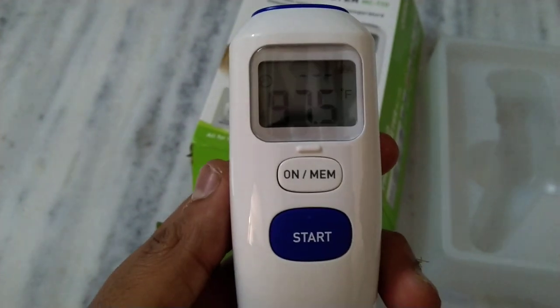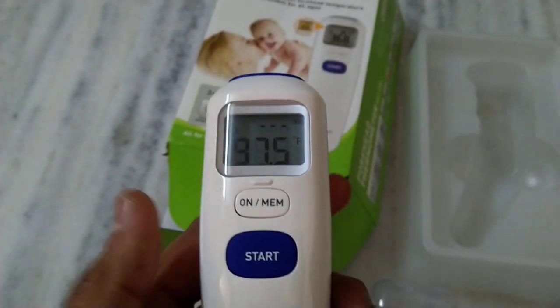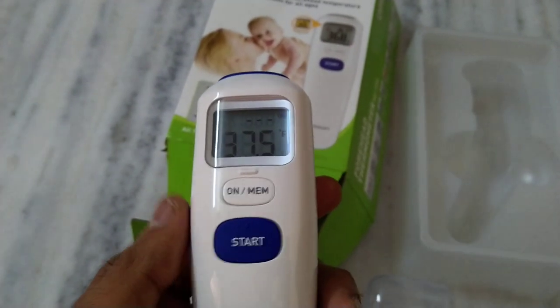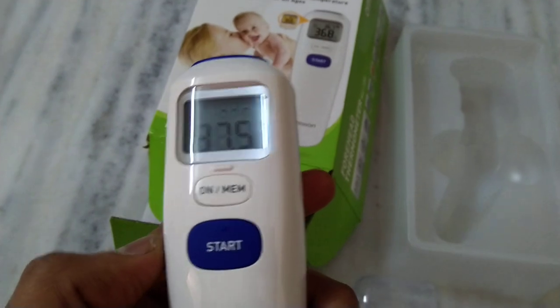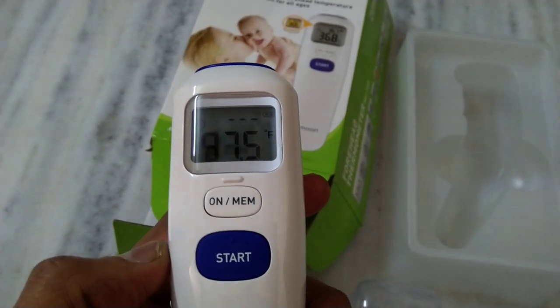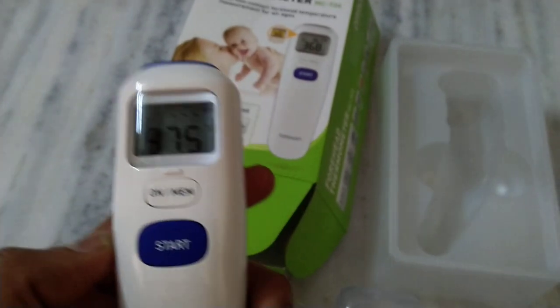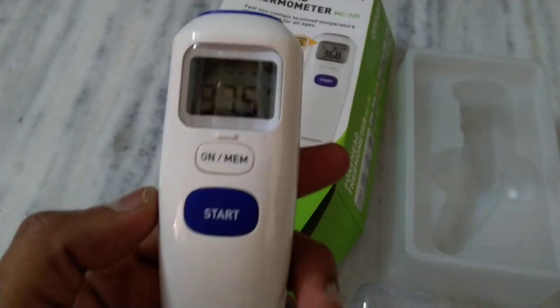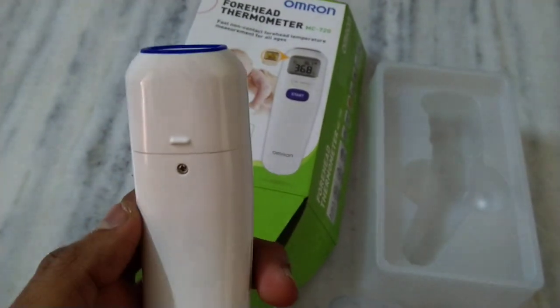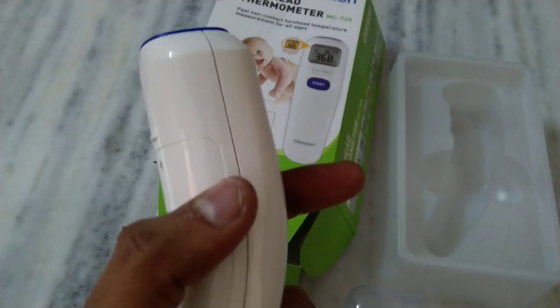Out of the box you'll get Celsius mode. If you want to change units, press and hold the MEM button for three seconds. You can also toggle the buzzer on or off and change the modes. It's all clearly written in the manual.